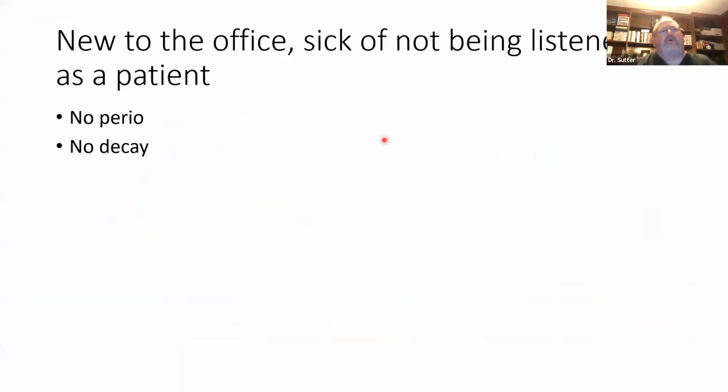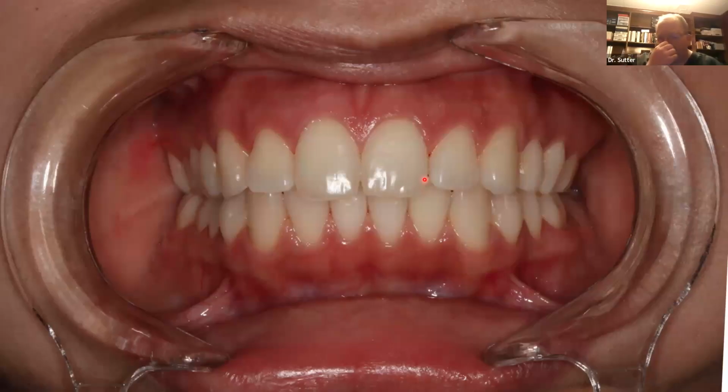All right. So here we go. I just pulled this out of the archives today. That's why you're looking at black letters on a white screen. This patient, it's brand new patient, new to the office, and she's tired of not being listened to as a patient. She has no perio, no decay. And this is how she presents.